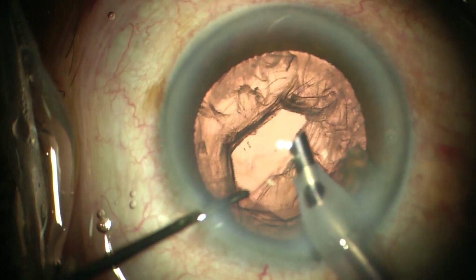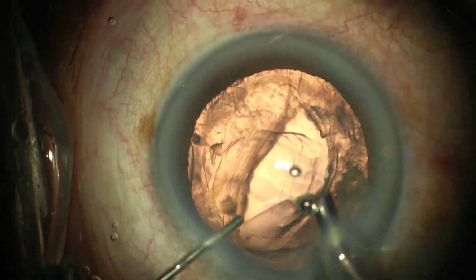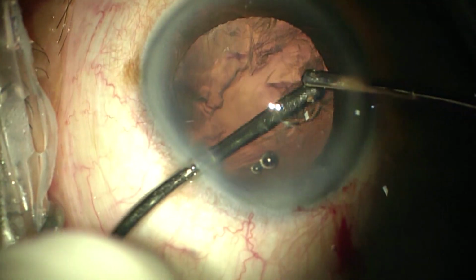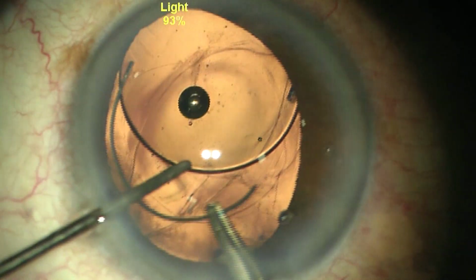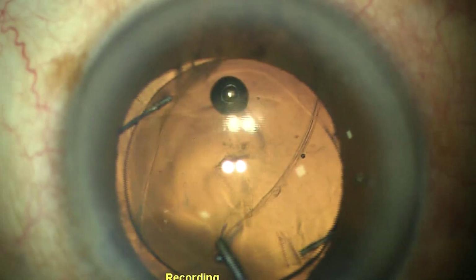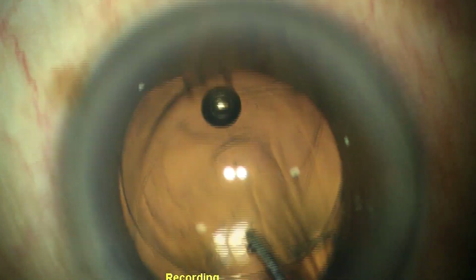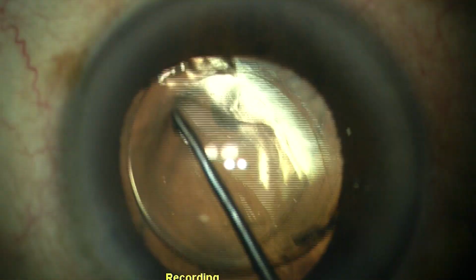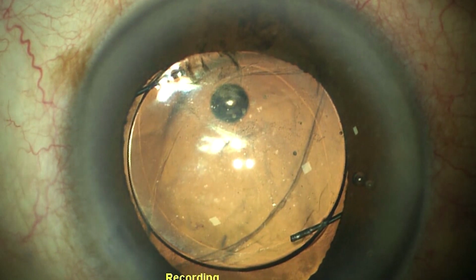Again, keeping the anterior chamber maintainer, introducing Viscoat into the anterior chamber and doing an anterior vitrectomy and then removing the cortex and the epinucleus and putting a multi-piece lens in the sulcus and capturing the optic of the lens into the capsulorhexis margin. This is called the optic capture, which ensures a long-term stability of the lens and also prevents UGH syndrome since the IOL is located actually in the bag, the haptics in the sulcus.